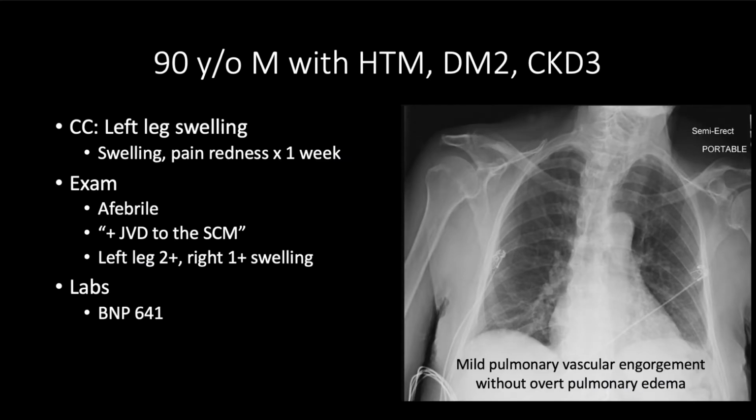All right, so let's go through another clinical scenario. This is a 90-year-old male with hypertension, diabetes, and CKD. He comes in with left leg swelling. He notes swelling, pain, redness for about the last week or so.